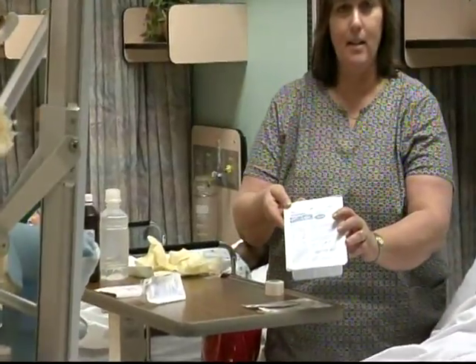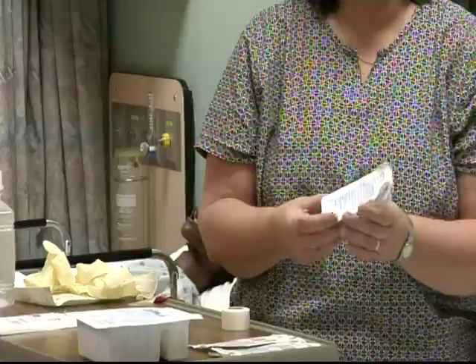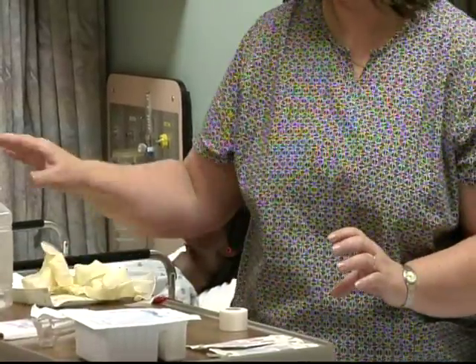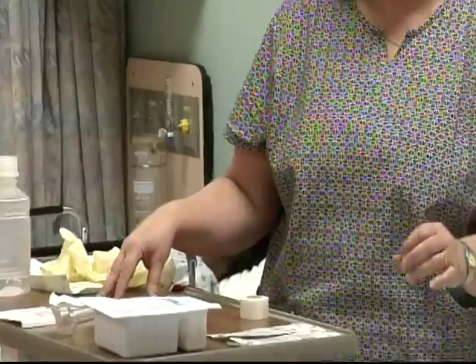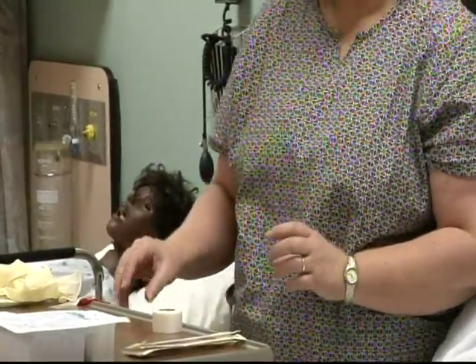You'll need a Trach Care kit. You will need your inner cannula that's the same size as your patient's. You will need a drain sponge. You will need normal saline, peroxide, clean gloves, sterile gloves, because this is a sterile procedure, and then you will need your Q-tips and some type of bio bag.